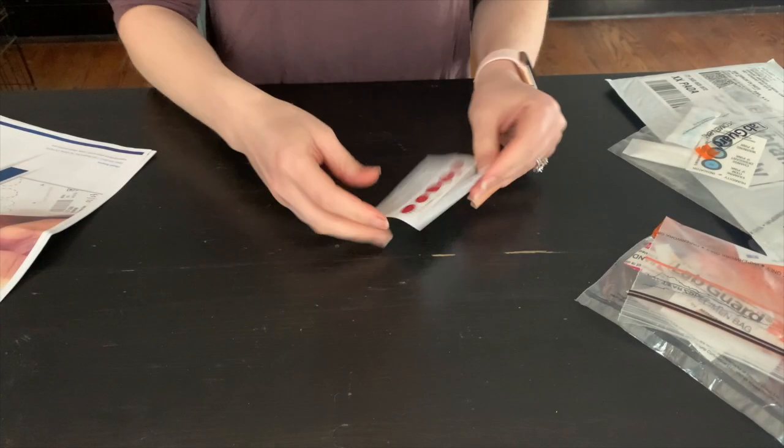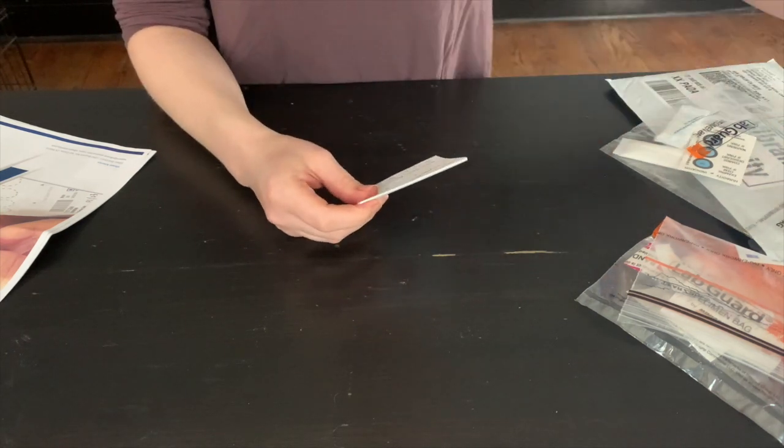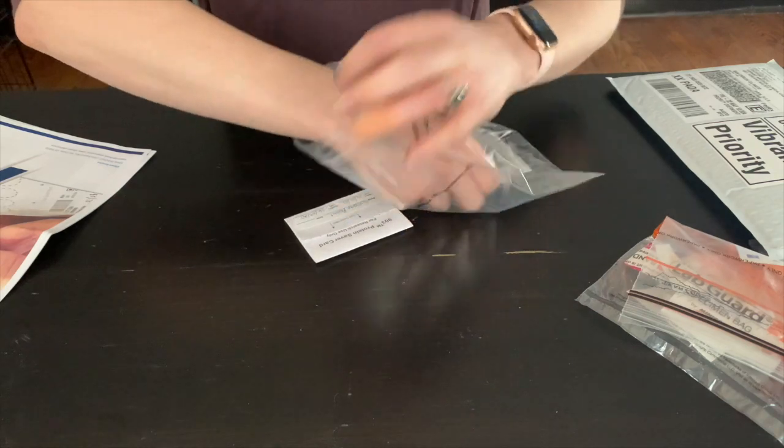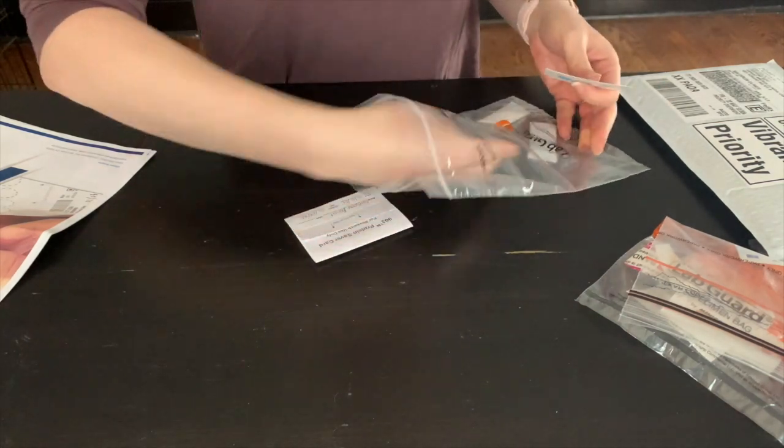After the blood spots have dried for at least two hours, fold the collection card. Place it in the empty biohazard bag along with the humidity indicator and silica gel packs and seal it tight.